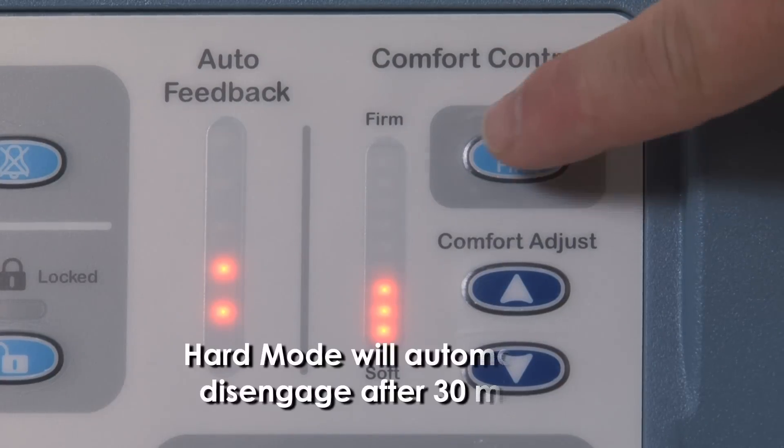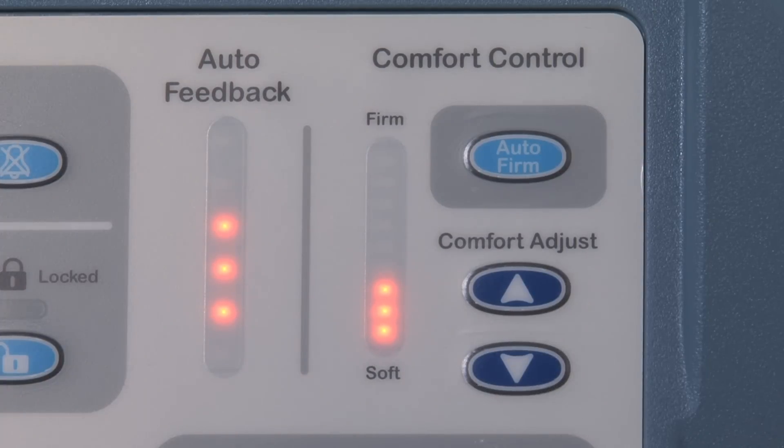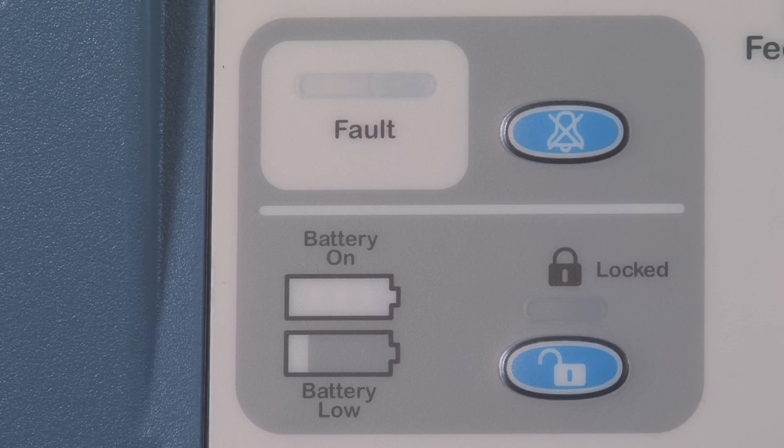Pressing AutoFirm will fully inflate the mattress. AutoFirm is designed to facilitate patient transfer and positioning. AutoFirm will automatically disengage after 30 minutes and return to the previous comfort setting if not done so manually.